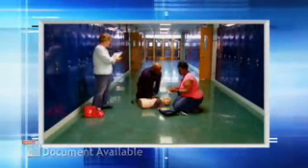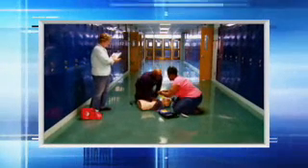Just as sports teams prepare for the big game, emergency response teams must practice to ensure an automatic and efficient response in an emergency. Cardiac emergency response should be a part of your school's comprehensive emergency response plan. Be sure that each team member is familiar with the location and content of this plan. Using a mannequin and a predetermined reality-based drill scenario allows the team to go through each step of the emergency response just as they would in a real emergency.